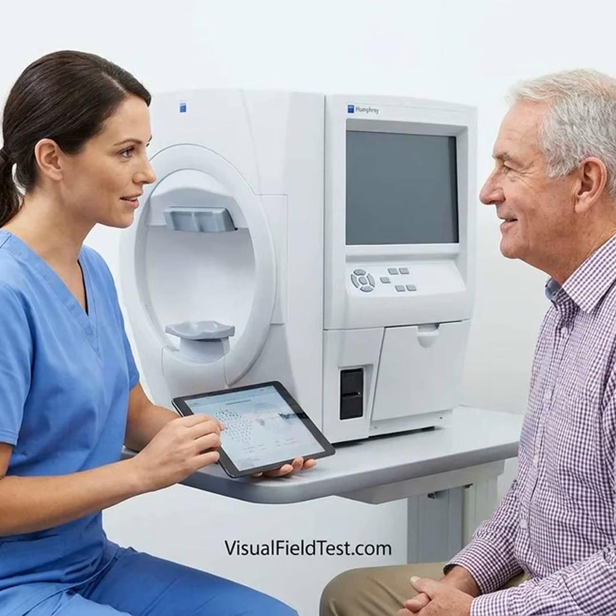Educational interventions that improve performance. Short educational videos. A 3 to 5 minute video can show the patient what the instrument looks like, where to look, how the button works, and what the flashes will feel like during the test. A randomized study of 244 patients undergoing their first automated visual field test used a 4.5 minute educational video. Reliable results in both eyes were obtained in 75.9% of patients who watched the video, versus 61.4% of patients who received usual instruction without the video.